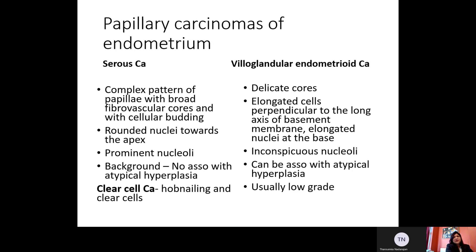When it is serous carcinoma, we can see a complex pattern of papillary with broad fibrovascular cores and cellular budding. Rounded nuclei are present towards the apex with prominent nucleoli. The background of the tumor shows no association with atypical hyperplasia. For villoglandular endometrioid carcinoma, we have delicate fibrovascular cores with elongated cells perpendicular to the long axis of the basement membrane and elongated nuclei present at the base of the cell. Nucleoli are inconspicuous and these cases can be associated with atypical hyperplasia and are usually low-grade.